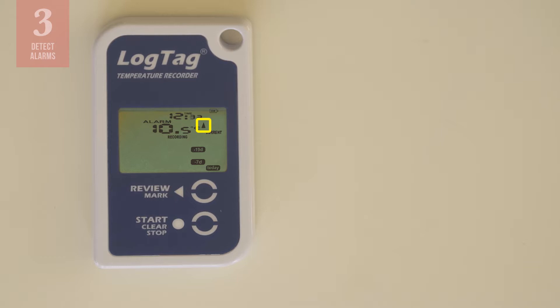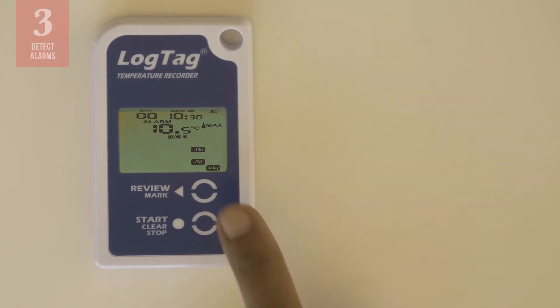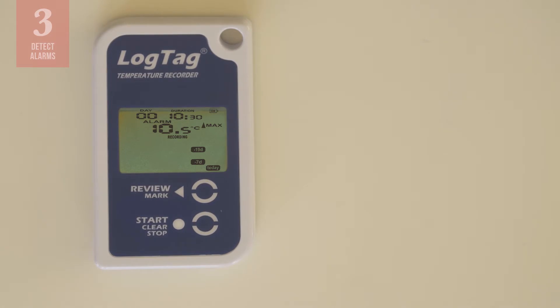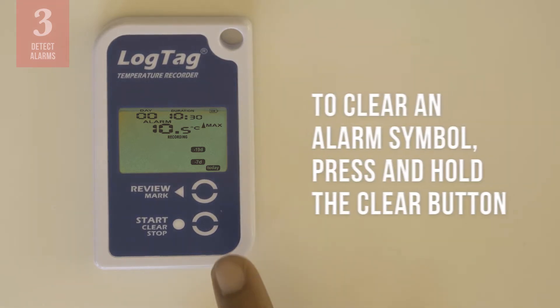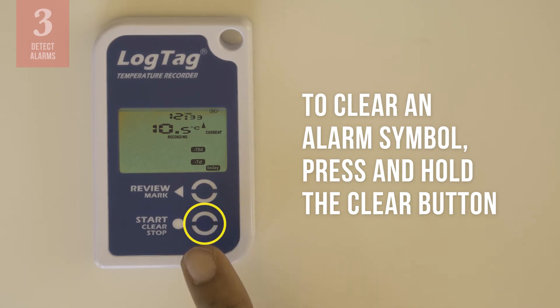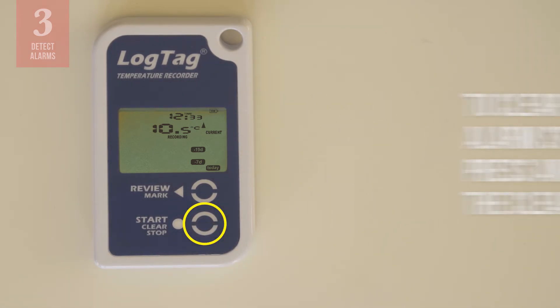The up arrow confirms that this temperature is above the 8 degrees Celsius limit. To find out more about this alarm, you can press review to see the day's maximum temperature. This display shows you the maximum temperature for the day as well as the duration of the high temperatures. Here, you can see that the maximum temperature was 10.5 degrees Celsius and that temperatures were above 8 degrees Celsius for 10 and a half hours. To clear an alarm symbol, press and hold the round button next to the word clear. The alarm data will be stored and can be viewed for 30 days.